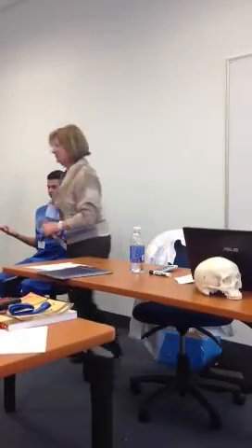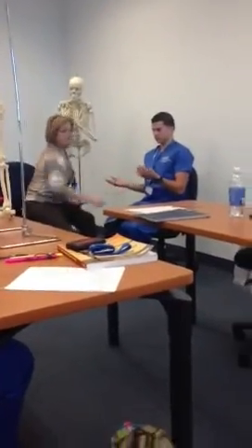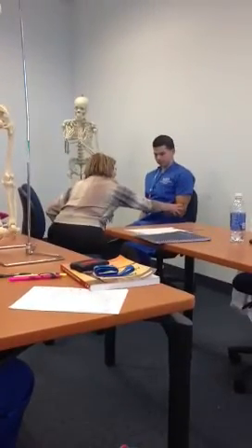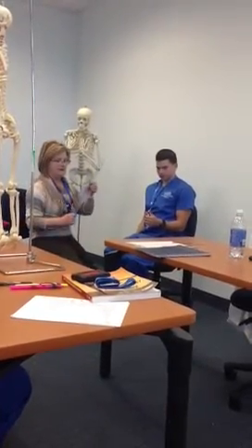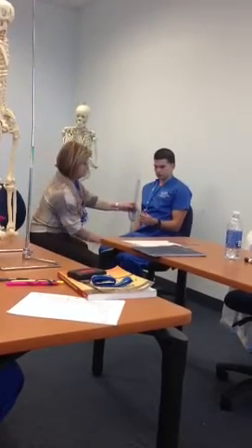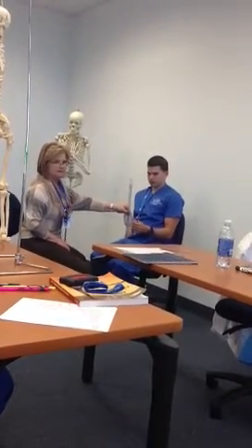That's an interesting one. Usually, when you do supination, pronation, you ask your patient to hold a pen. Okay? That arm, again, needs to be there. So what we do is we align your stationary and your movable arm. So what plane is this? Frontal. What is the axis? Sagittal.